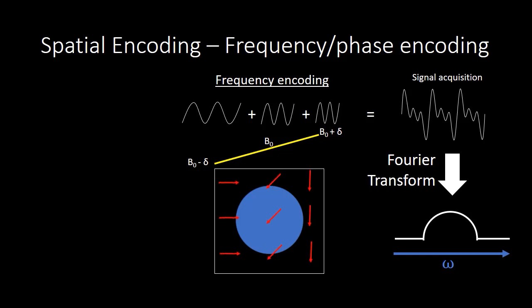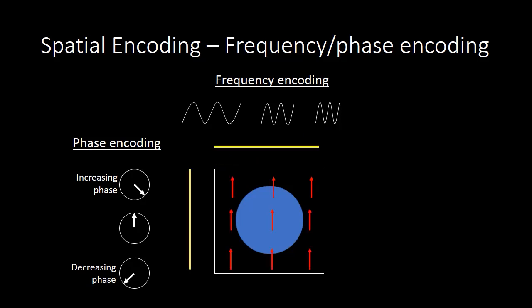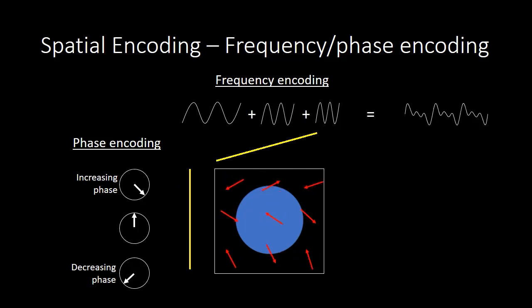And so in order to gain that information, we use phase encoding. This is sort of like a preparatory step where we distribute the phase along the vertical dimension before we acquire the signal while varying the frequency along the horizontal dimension. So for example, we can apply a phase encoding gradient, which creates a distribution of phase along the vertical dimension, and then follow that up with a frequency encoding gradient while we're acquiring our signal, which allows us to encode the frequency along the horizontal dimension.